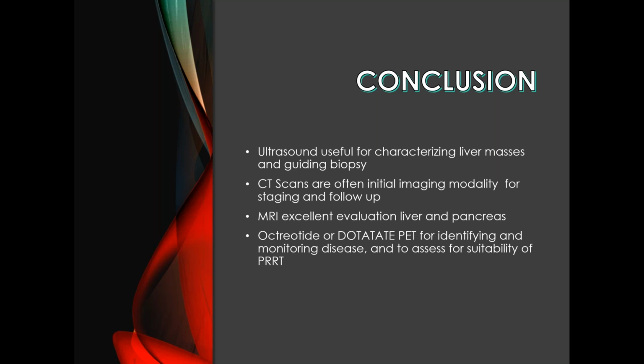So there's two different imaging and two different sizes, and the difference could make an impact on whether or not they have surgery. Personally, in terms of the pancreas, I would say that probably the MRI is something that you can rely on because you have excellent spatial resolution and tissue resolution in terms of contrast resolution. So I would favor the MRI in this case.